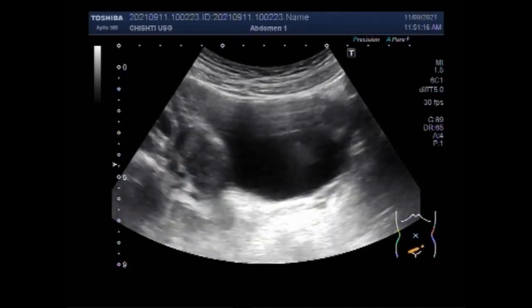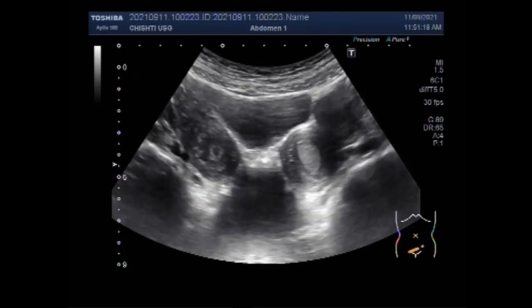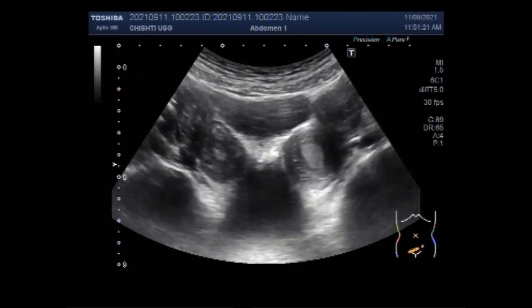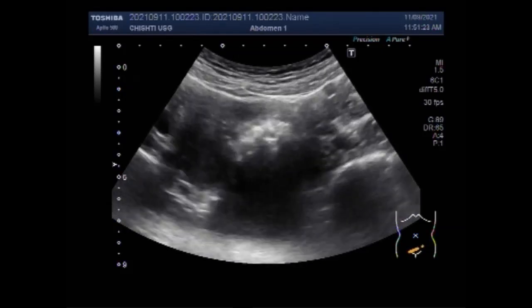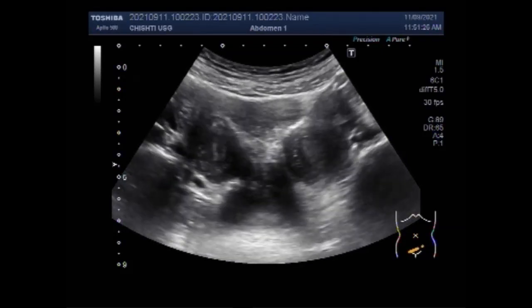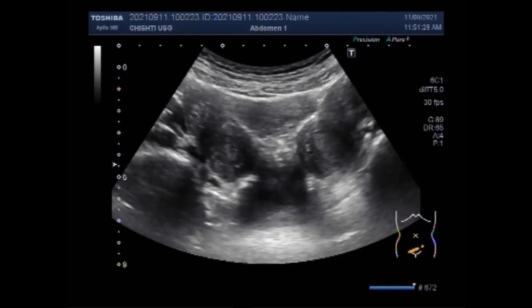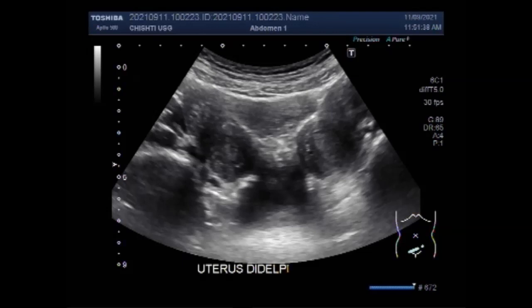Now you can see both the uteruses, and each uterus has its own cervix — the cervix is not shared between them. So every uterus has its own fallopian tube, its own ovary, and its own cervix.